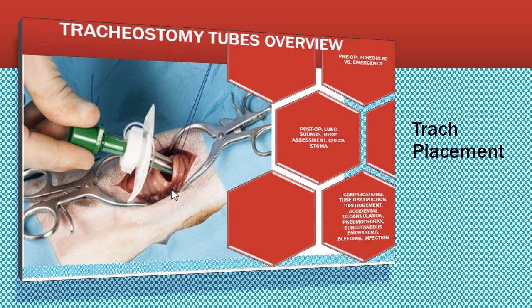What are some of the ways that you're going to watch the patient? Think about how you're going to watch this patient for tube obstruction. Think about how you're going to watch this patient for tube dislodgement and accidental decannulation. How are you going to watch this patient for pneumothorax, subcutaneous emphysema, bleeding, or infection?